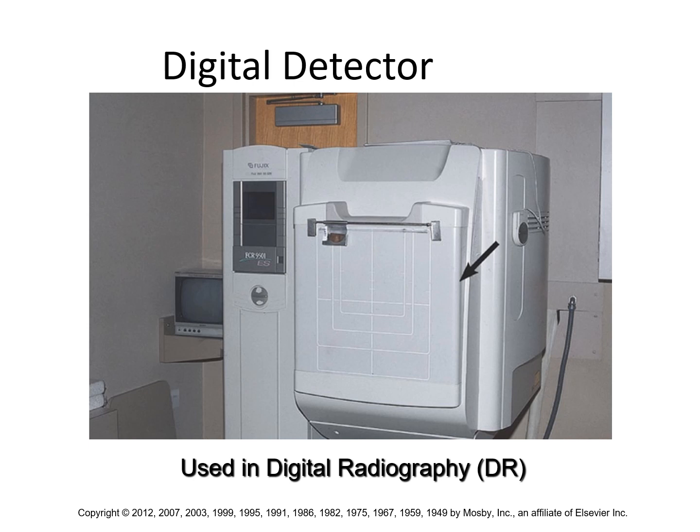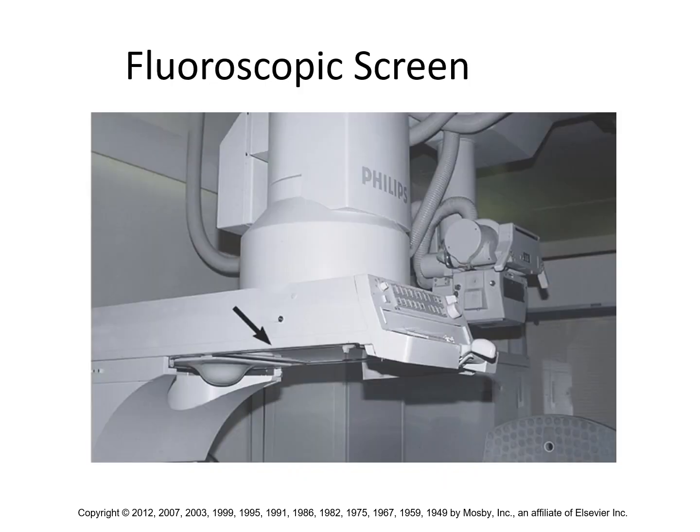We don't need a separate integrated detector arranged vertically and then another one arranged horizontally. We can just build a module wireless detector, and then it can be fit into a vertical holding stand or slipped into the table in a horizontal holding stand, okay, which would be the buckies that we used to use for the film cassettes. Okay.